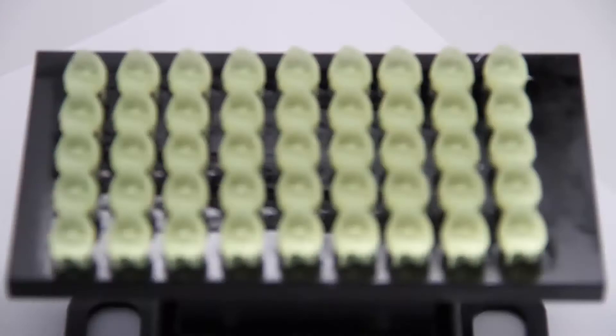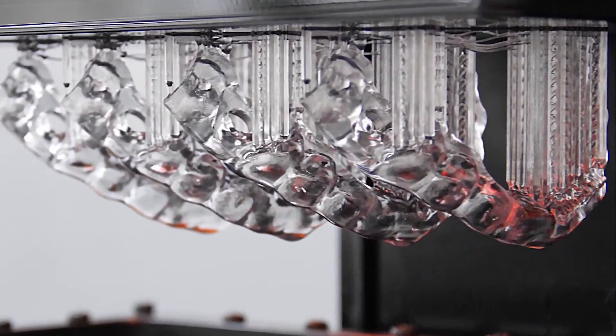Dental equipment needs to be very accurate. So when you're thinking about doing temporary crowns, dentures, night guards, you have to have a very accurate 3D printer.